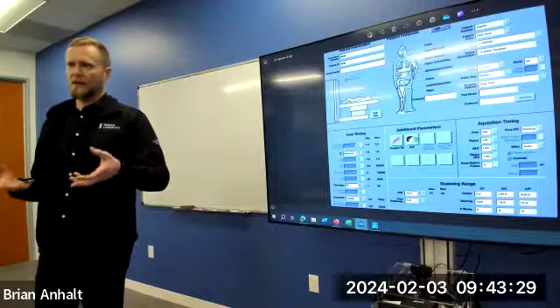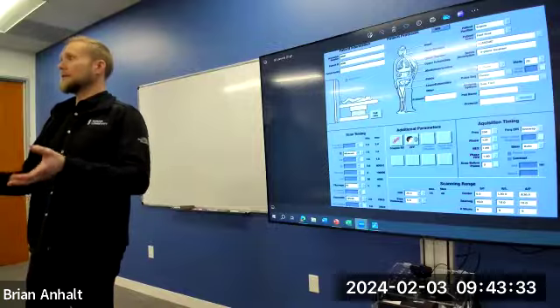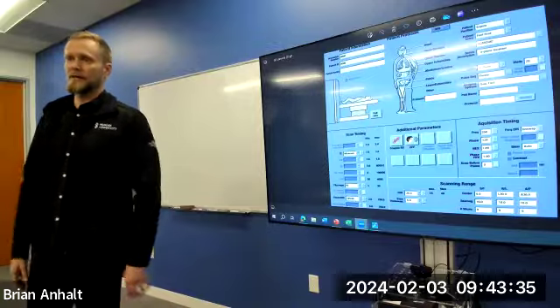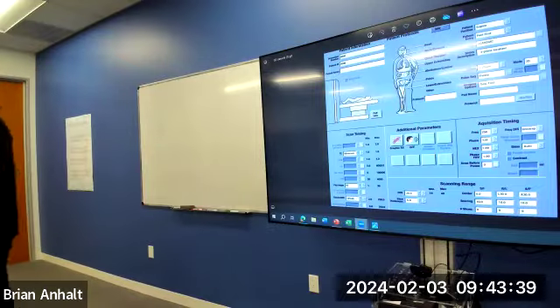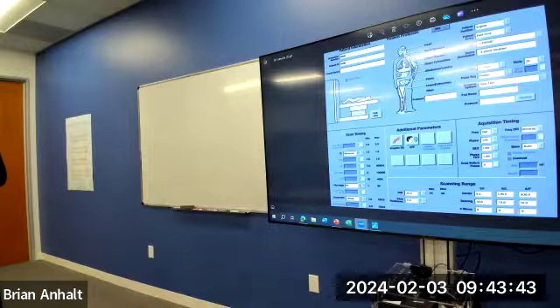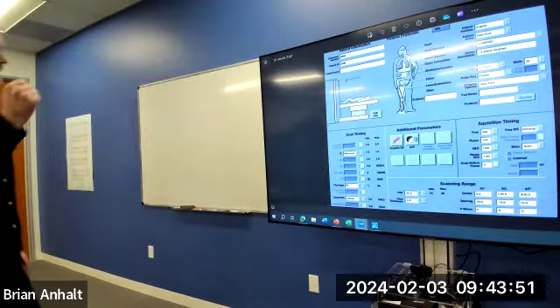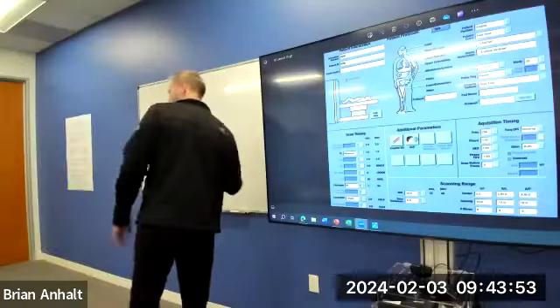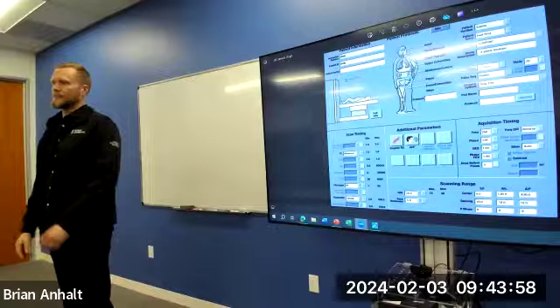And we're gonna find out today, coils are a big factor in your signal to noise ratio. So if we change the coil, things might change. Patient might not produce the same type of quality because they're moving or something's going on. You might have to make adjustments. You might have to do things faster than you normally would because you need to get the person out of there, but you got to get certain pictures before they move, right? So parameters and trade-offs, I think in your book, it's called protocol optimization. Same thing. We're going over the same material.